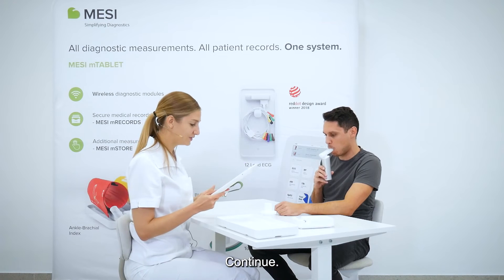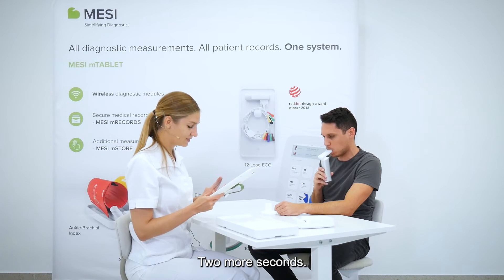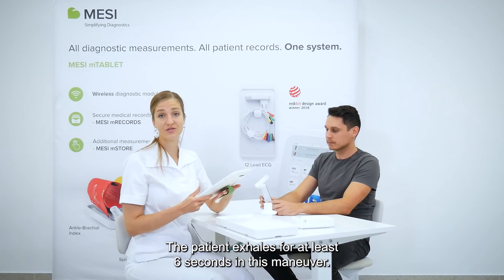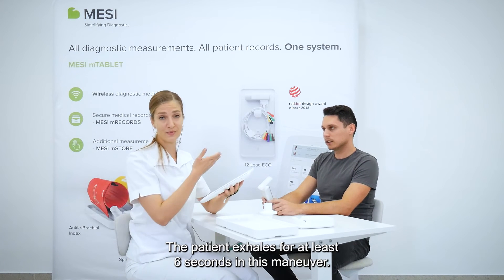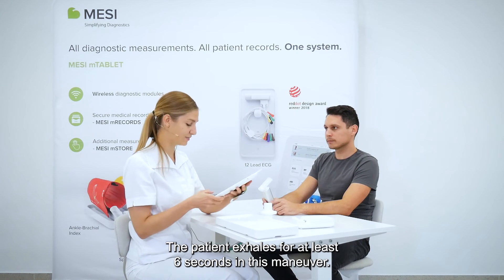Continue — two more seconds. The patient is blowing for at least six seconds in this maneuver.